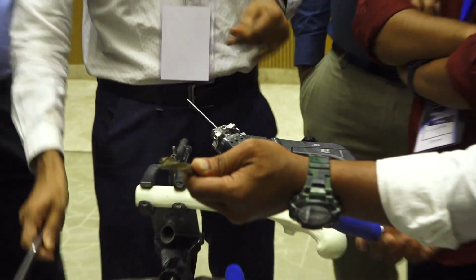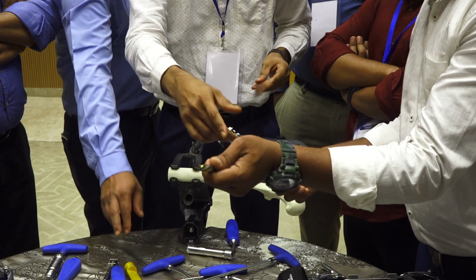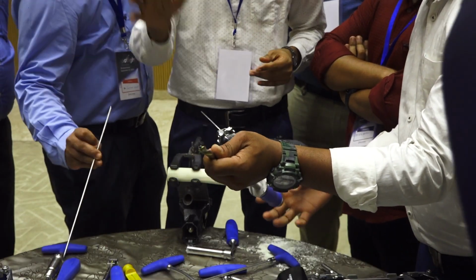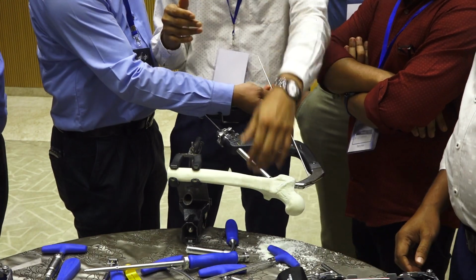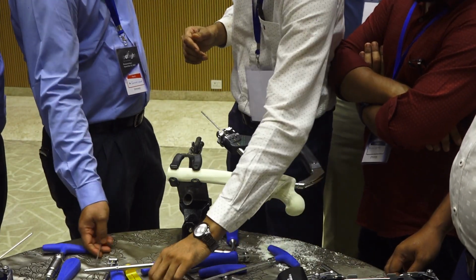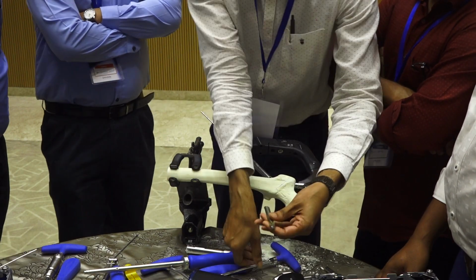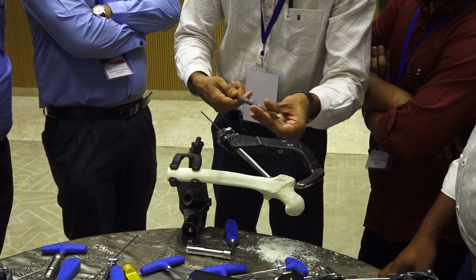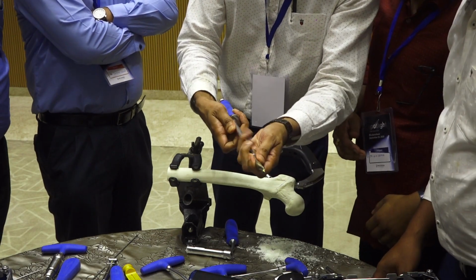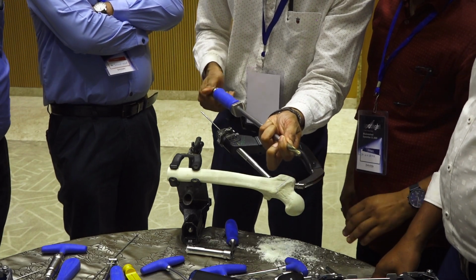Then you take the helical blade and see how it is inserted. Actually, you should always try to do this yourself with the help of company people, because most of the time they will give it to you like this. So if someday they do not come, you will have great difficulty in putting this attachment there. It will fit like this, and there is an inner locking mechanism.